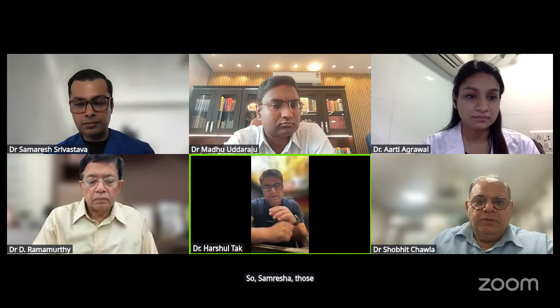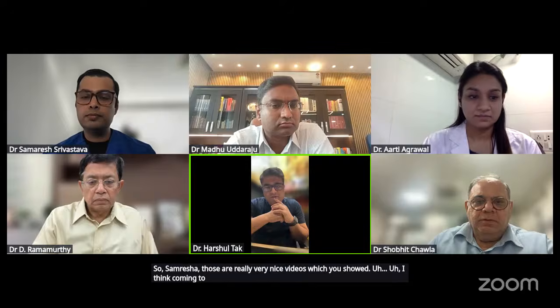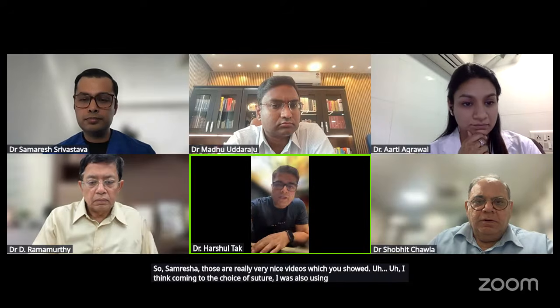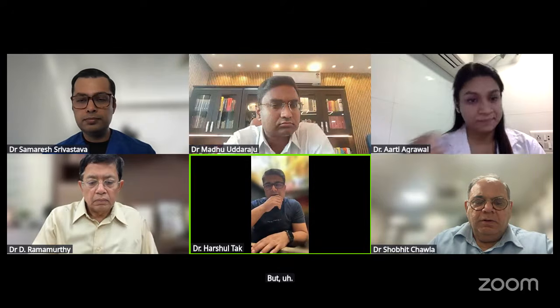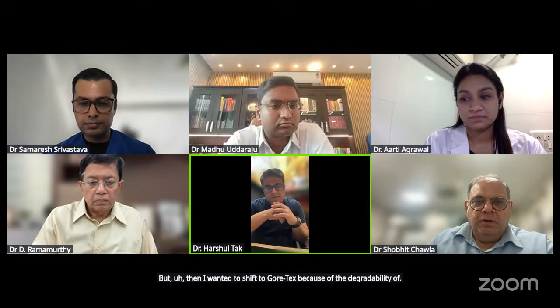So, Samresh, those are really very nice videos which you showed. I think coming to the choice of suture, I was also using 9-0 Prolene, but then I wanted to shift to Gore-Tex because of the degradability of 9-0 Prolene over years.